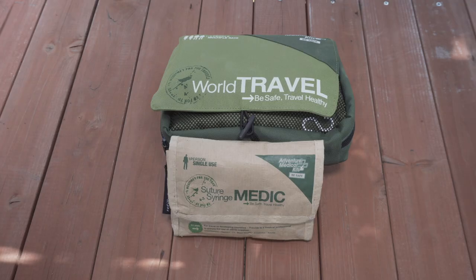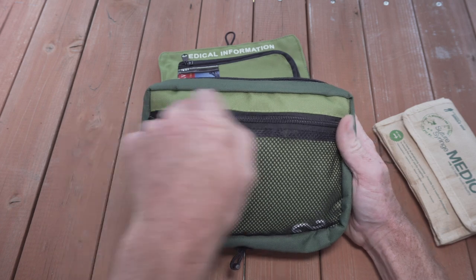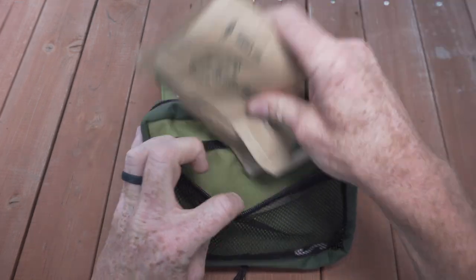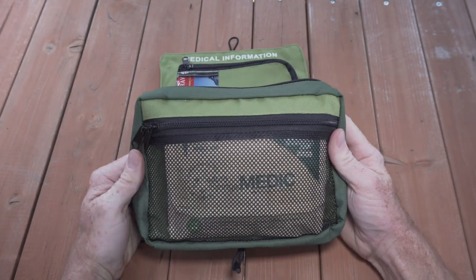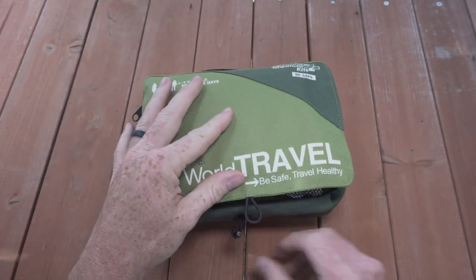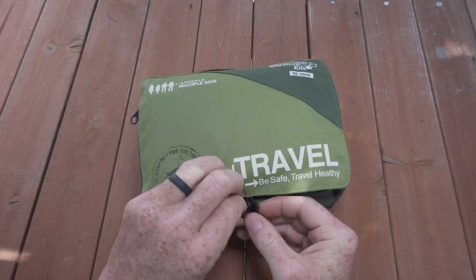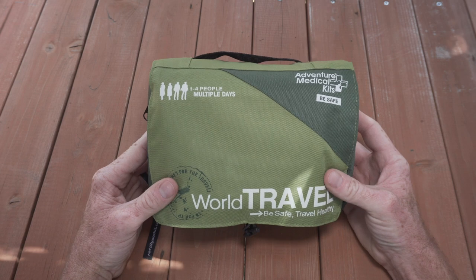One of the nice features is that it pairs perfectly with either the Smart or the World Travel Kit by Adventure Medical Kits. They both contain a front mesh pocket that this kit fits into perfectly. You can stick it in your World Travel Kit, zip it up, and have a pretty comprehensive kit to take with you whenever you're heading into these environments.